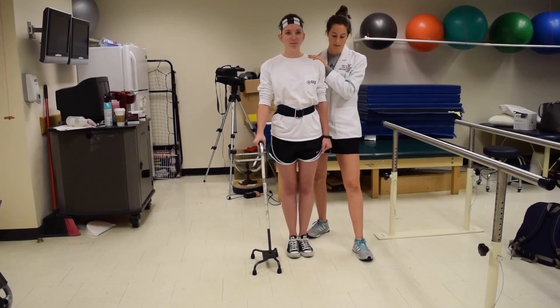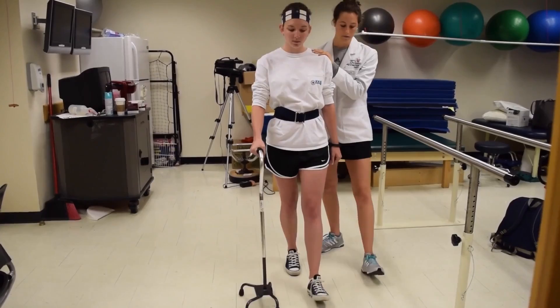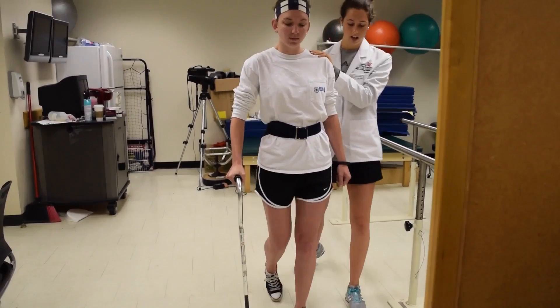On the count of three, we're going to take that first step. One, two, three. Then you can bring that right foot forward. How'd that feel? Good. Let's take two more. And then you can do this one when you're ready. Great, does that all feel comfortable? Wonderful.